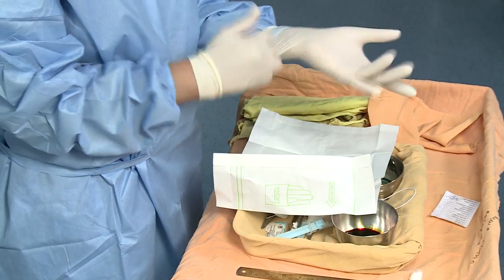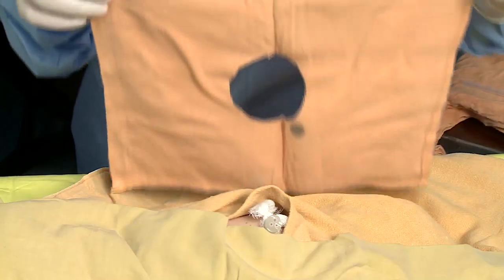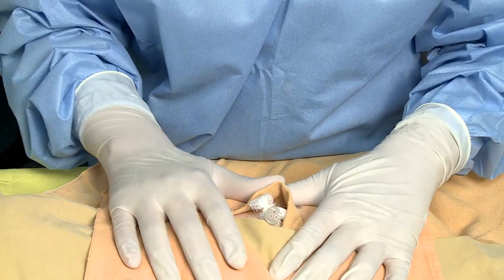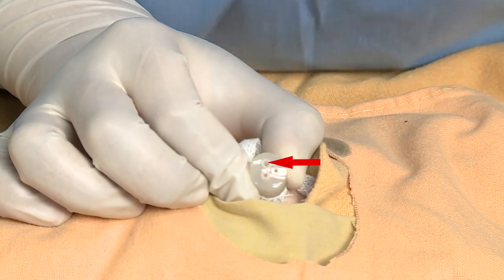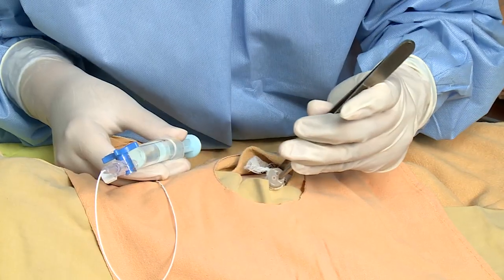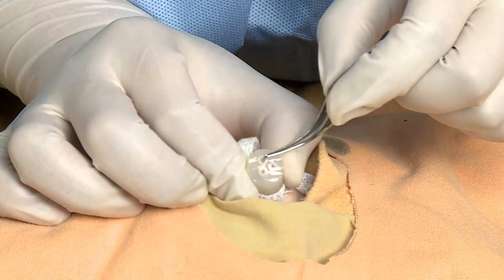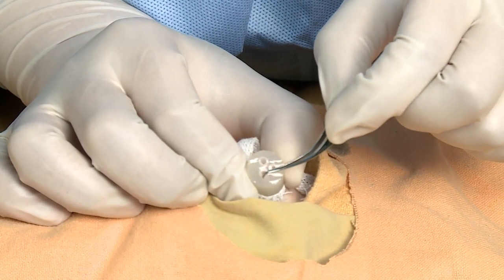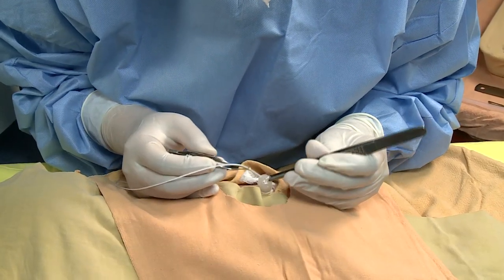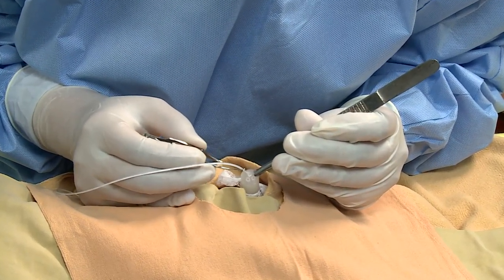Cut the cord horizontally with a scalpel about 1 to 1.5 cm from the skin. Wear a fresh pair of gloves. Identify the thin-walled, high-caliber vein close to the periphery of the umbilical stump. Grasp the cord stump with toothed forceps. Gently insert the tips of iris forceps into the lumen of the vein and remove any clots. Introduce the fluid-filled catheter attached to the stopcock and syringe 2 to 3 cm into the vein.